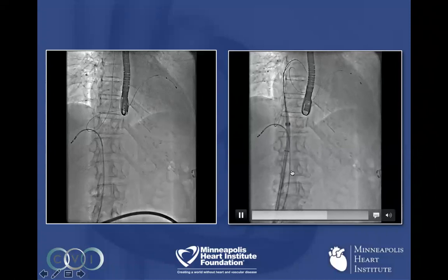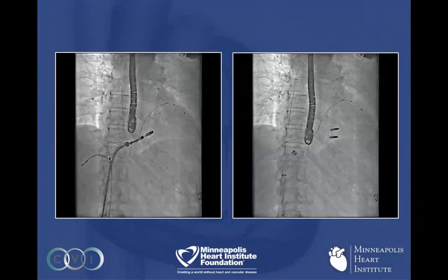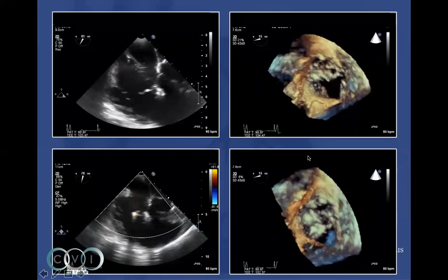Here's the MitraClip device being advanced up from the groin over a Safari stiff wire, and we're going to use this to place a couple of clips. You can see this snare, which is holding the lead in the liver, and the MitraClip being used off-label has been advanced into the right ventricle. We then advance one and then two clips — here's the first clip, here's the second clip. This is a steerable guide catheter used to deliver the clips. Here's that coronary sinus lead, which even after removal of the snare is still draped in the hepatic veins.